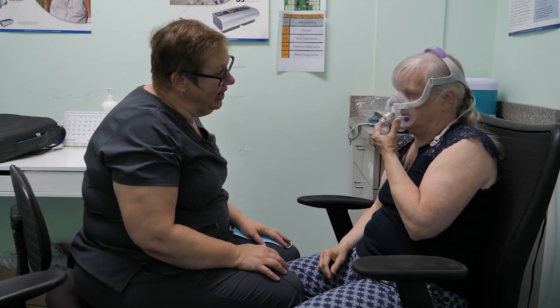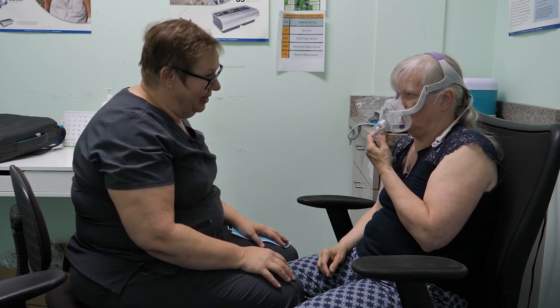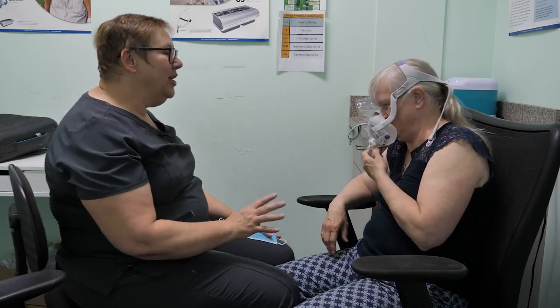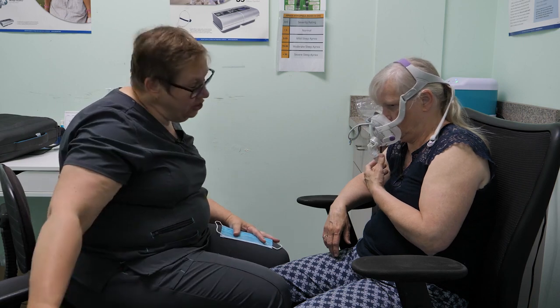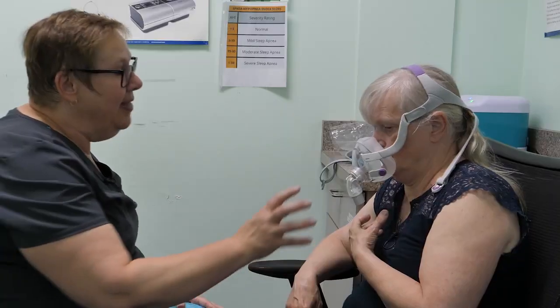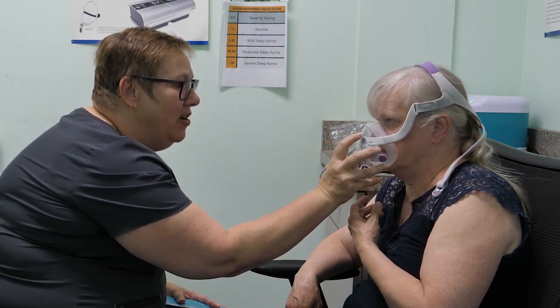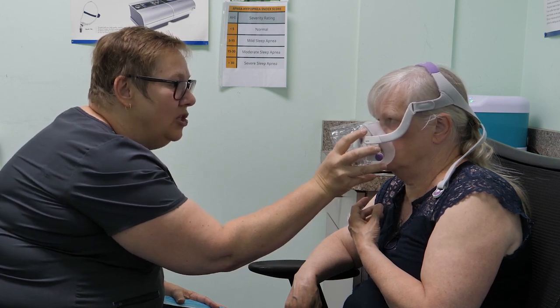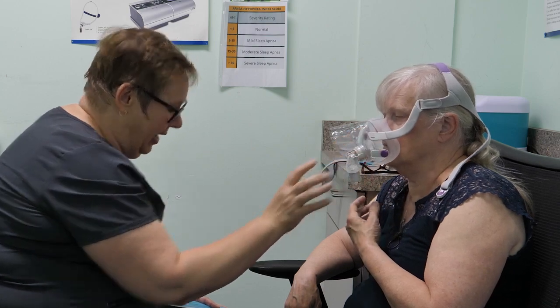Okay, does that feel all right? Okay, so you can just let go for a moment and just let it sit there, even if it just hangs for a moment. Okay, so before we do up the clips, what I'm going to show you is that I actually want you to put on the pressure to your mask in just a moment, and then I want you to very, very gently just take the mask, have it on your face like this, and very gently just lift it off 1, 2, 3 times, and I'm going to show you why, all right?